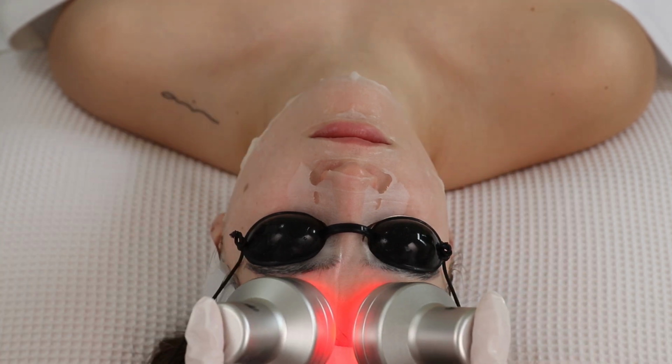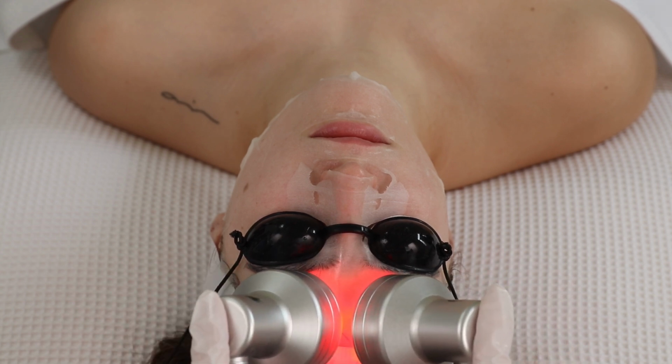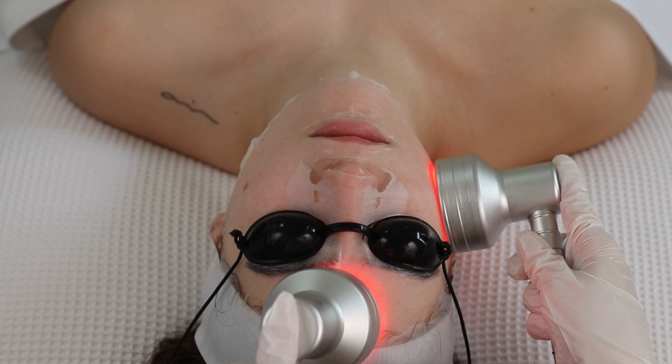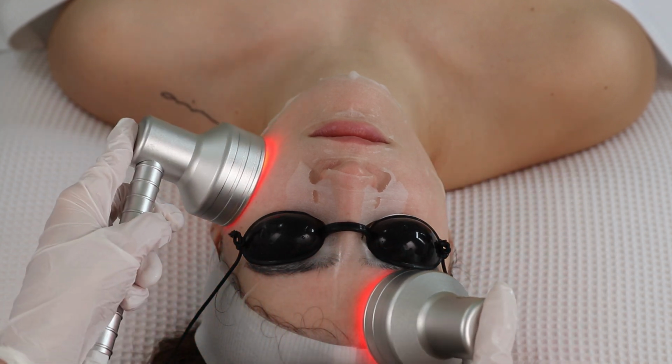Gently move your way up towards the forehead and the temples. For this client, we chose the red LED as it's anti-aging and also stimulates the production of collagen and elastin. You can also place each probe directly onto the skin and stay in one place for 30 seconds, allowing the light to penetrate deeper into the skin.